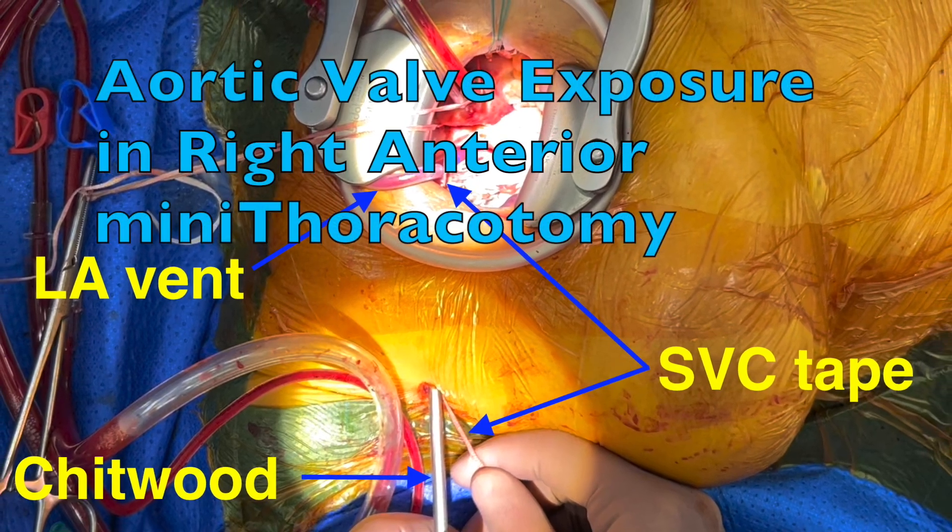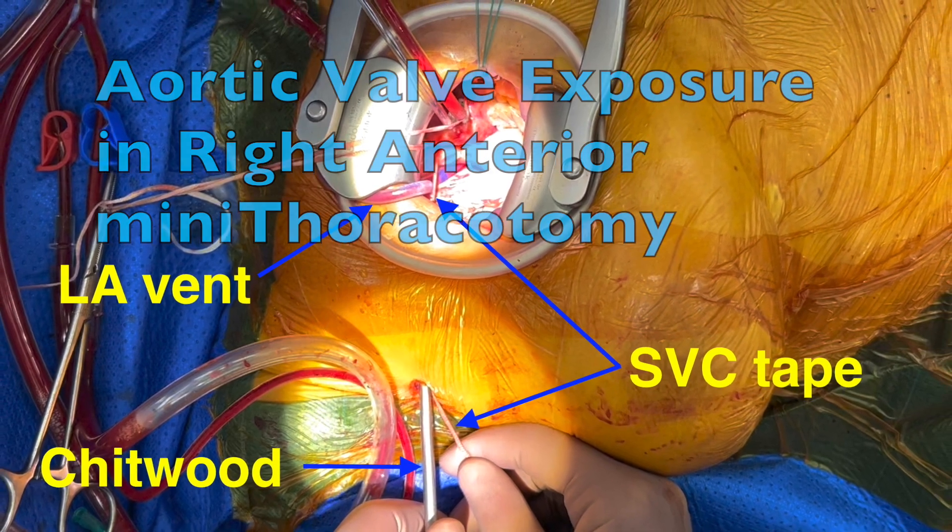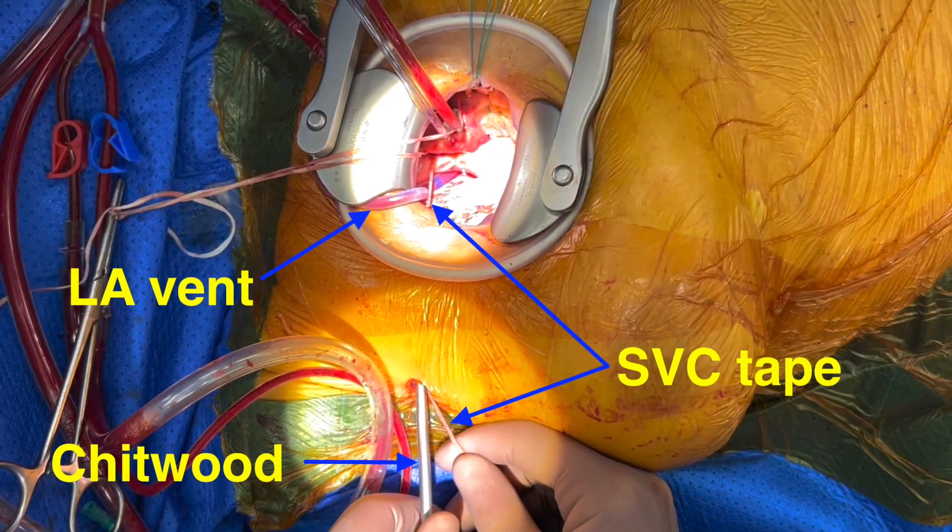This video is about how to improve the exposure of the aortic valve during aortic valve replacement through the right anterior mini thoracotomy.